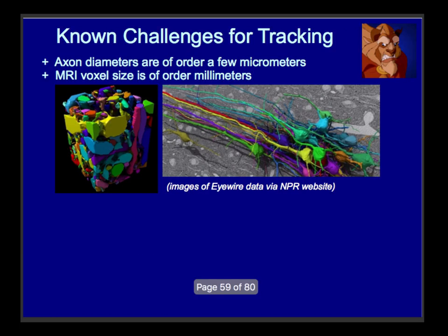Okay, talking about this program and some of these cartoon pictures, we might think this is a pretty easy thing to do. It's actually hard, and there's a lot of beast-likeness to it. As I mentioned, axon diameters are really tiny, and the structure is really complicated. These are not nice clean straws separated out.